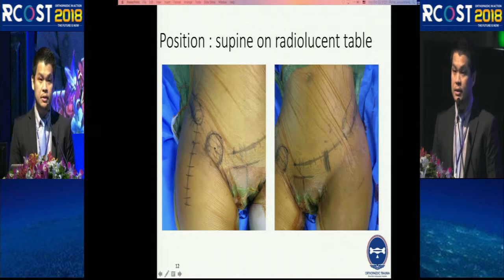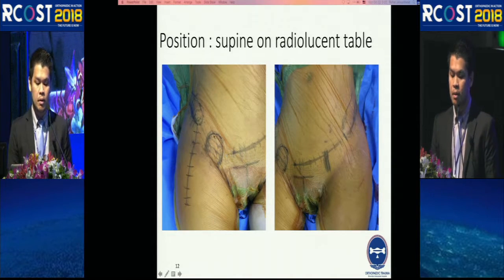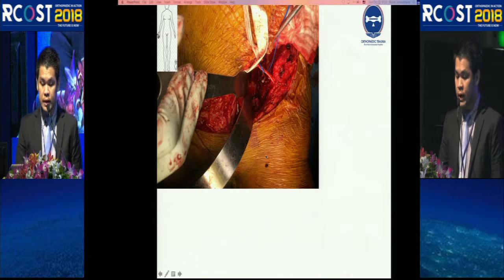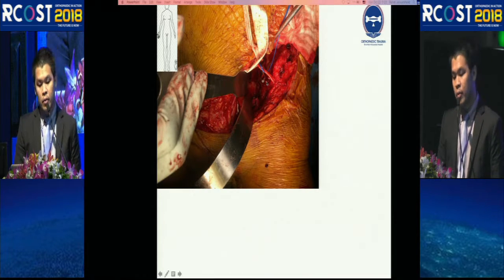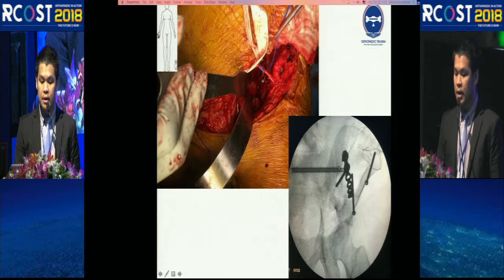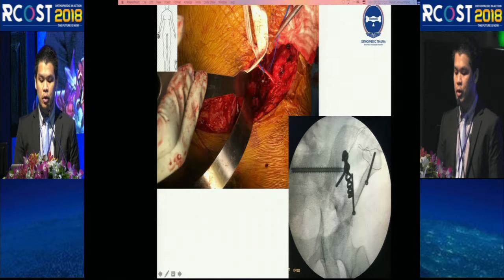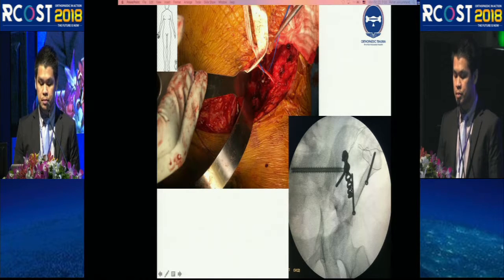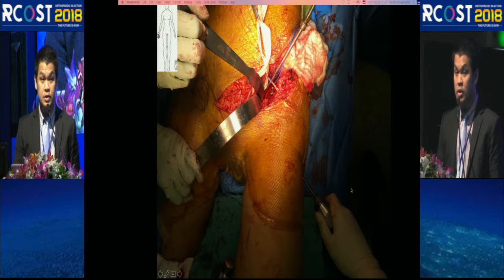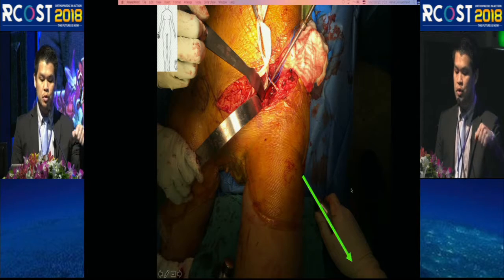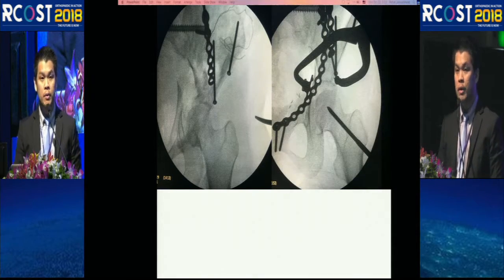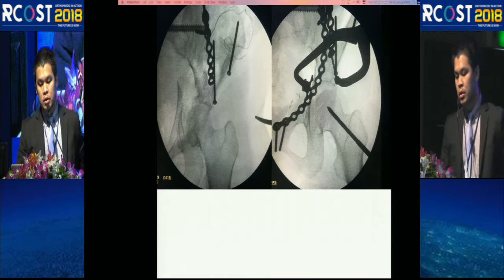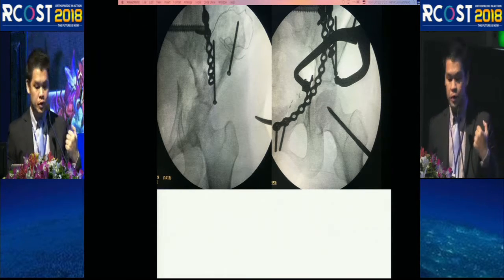You can palpate the femoral head here. Starting from the lateral window, I fix from the back to the front, buttressing the anterior column and fixing with some screws. Because it's a medial protrusio, we use traction from a pin to reduce it, and then use an asymmetrical clamp after fixing the anterior column to reduce the posterior column.